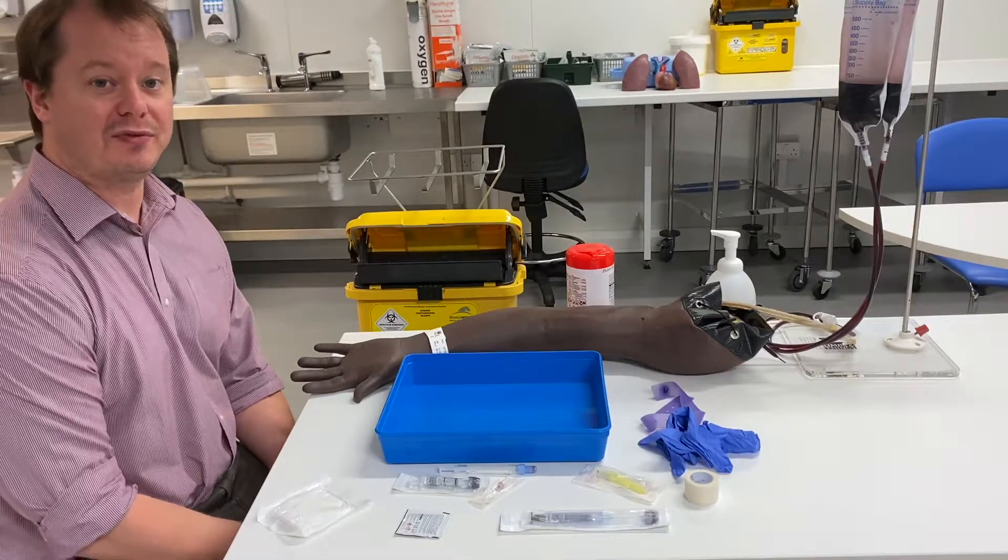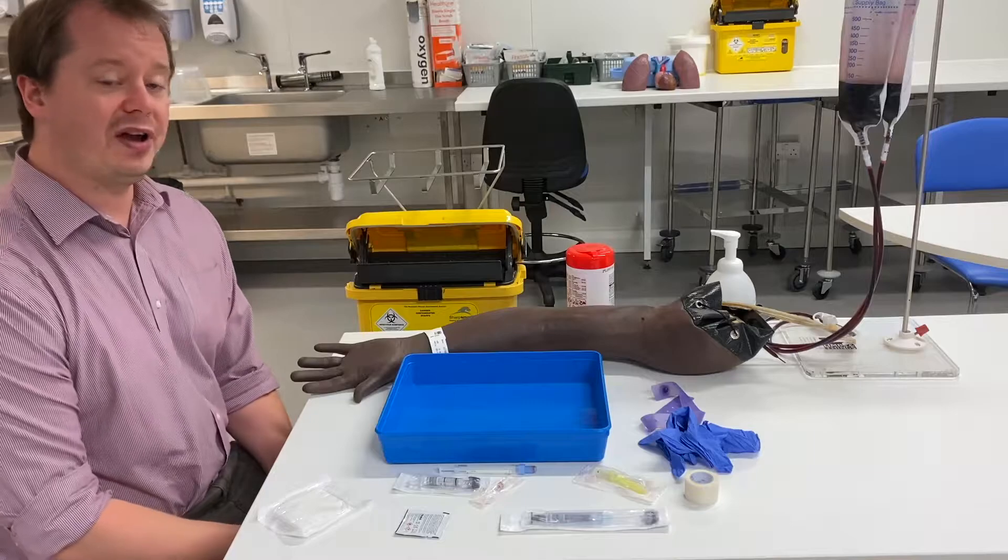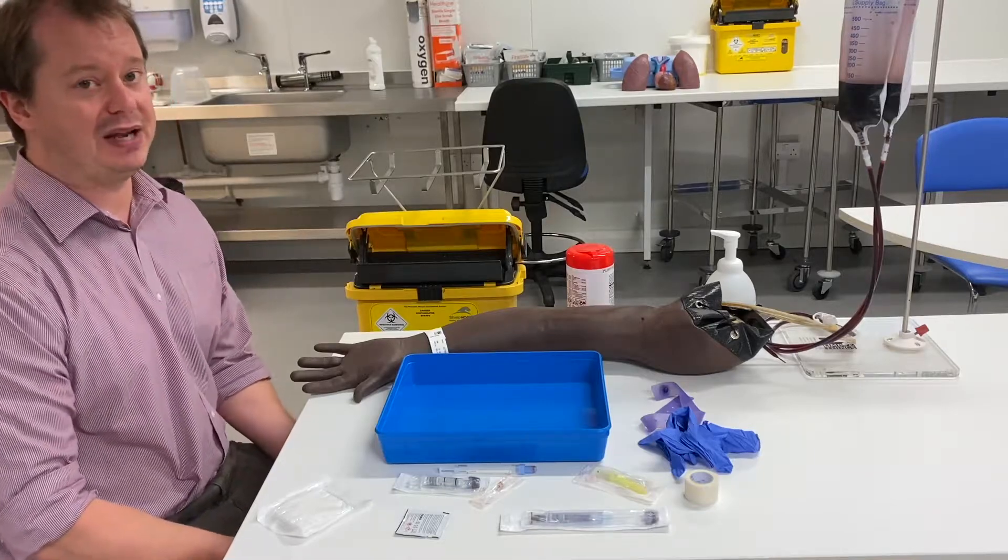Hello everyone, welcome to another thrilling installment of CGCM Practical Skills. What we're going to talk about in this video is venous blood gases.